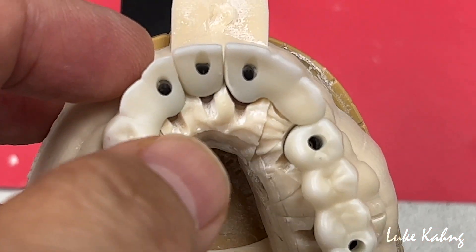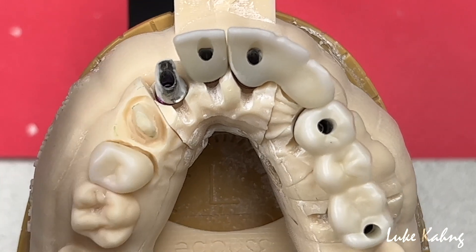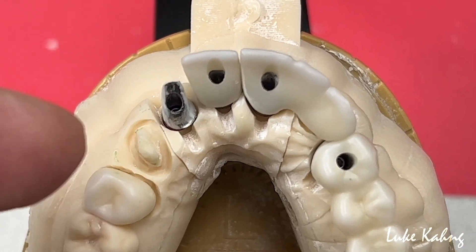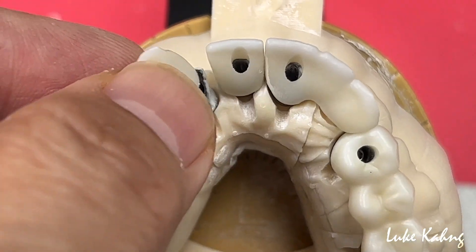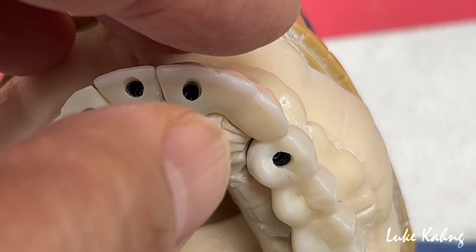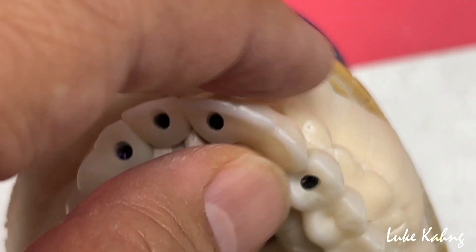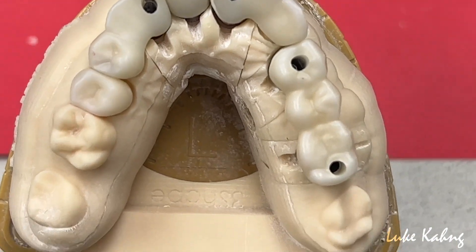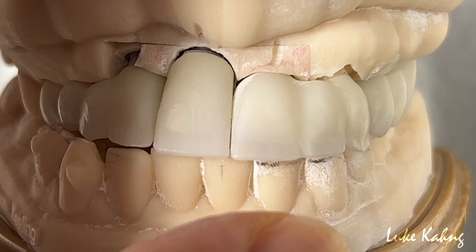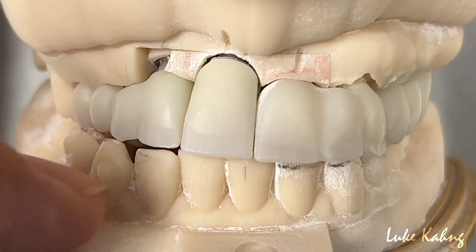After we made the intensive work, we scan again because the platform is too thick. I explained to you before — those areas really lack width. I have to create the facial, so unfortunately I have to make a 3-unit bridge, because otherwise it's not possible to make the facial aesthetic. Here is a little bit better but still the same issue in between those areas. I grind using the BND dental tool. The other issue is a lack of space slightly — I have to trim it for better aesthetic facial contours.